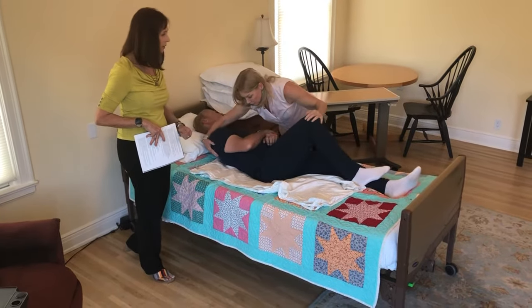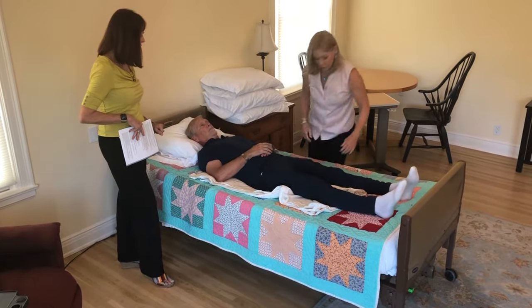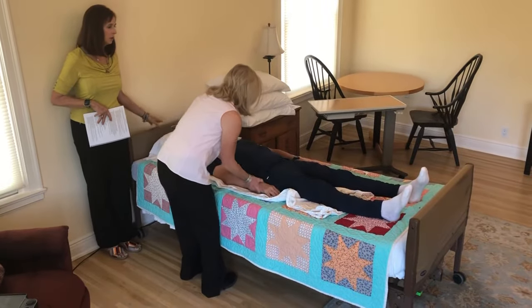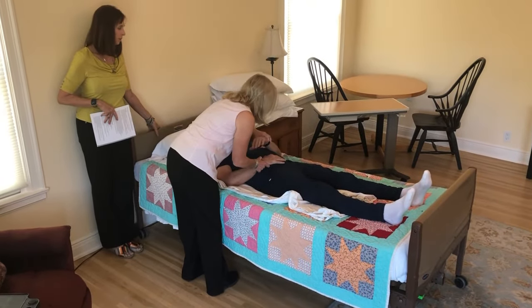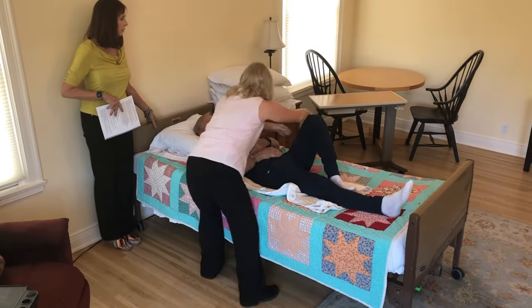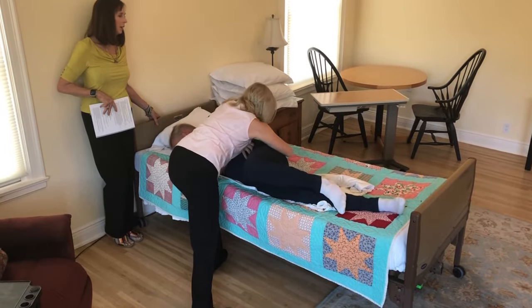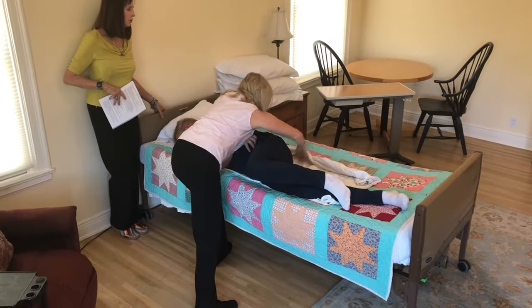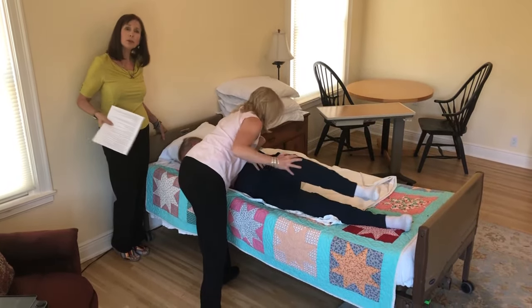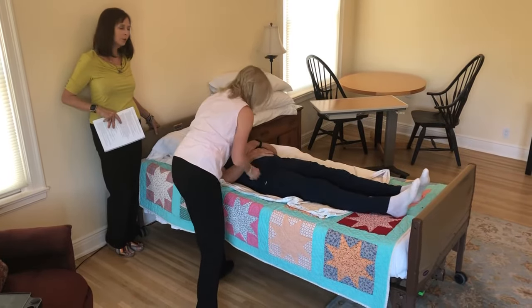You don't know how long it is because it depends on your sheet. Now she's going to lay him onto his back. She needs to come over to this side so that she can get that sheet on the other side opened up. She's going to repeat the exact process: bend the knee up, touch the shoulder, use her muscles to bring him towards her, and now you'll see that she unrolls the sheet. This is all done with one person. If there were both of us working on it, it'd be so much easier because we'd be on both sides of the bed, but this is for one person doing it.